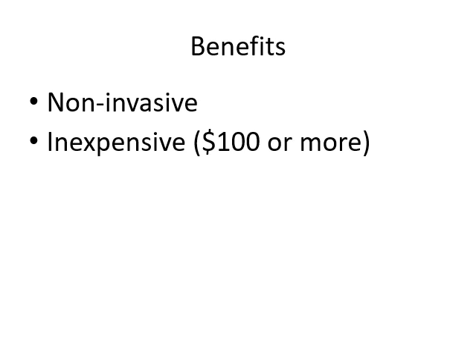Okay, so what are the benefits? The benefits are, again, it's non-invasive. Remember, I said all these things are going to be non-invasive. It's fairly inexpensive, about $100 or more depending on what ultrasound you're getting. And that includes the cost for the technologist. The technologist has to get paid. You have to pay for the equipment, and you have to pay for the radiologist to read it, so it's fairly inexpensive.